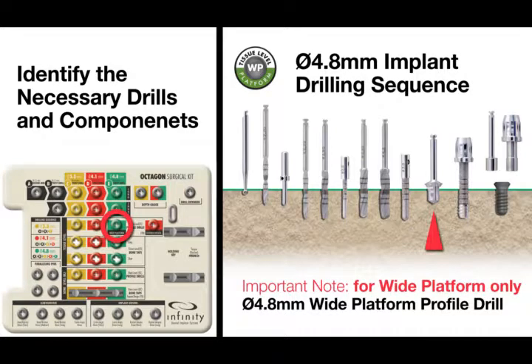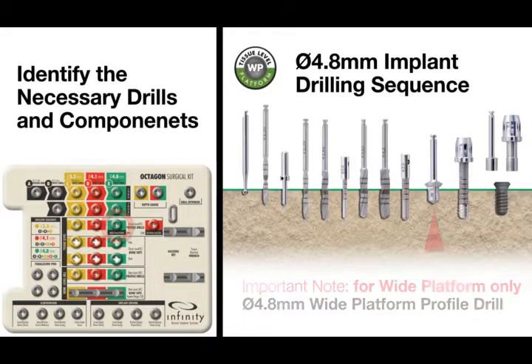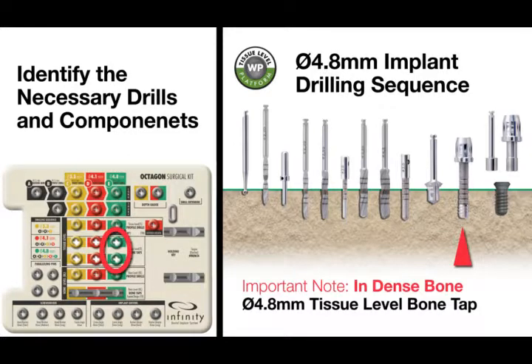Ninth, only when drilling for an OCTAGON 4.8 mm diameter wide platform tissue level implant, choose the wide platform profile drill from column E, marked in green on the surgical tray. This instrument location is clearly marked on the surgical tray with the letters WP and the words wide platform. When drilling for 4.8 mm tissue level implants in dense bone, choose the 4.8 mm diameter tissue level bone tap from column E, marked in green on the surgical tray.